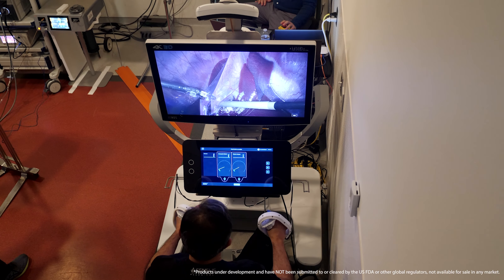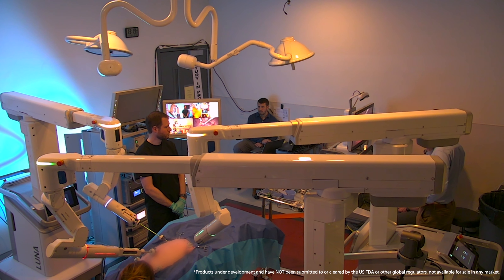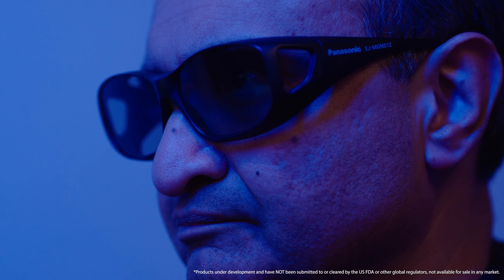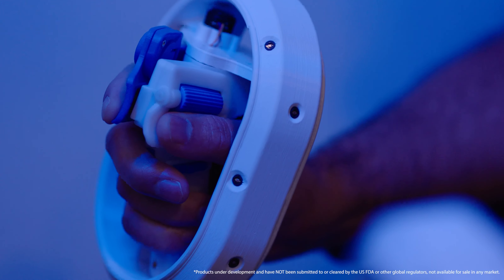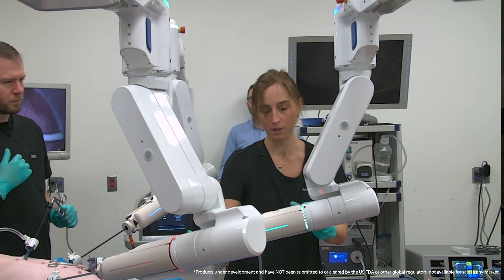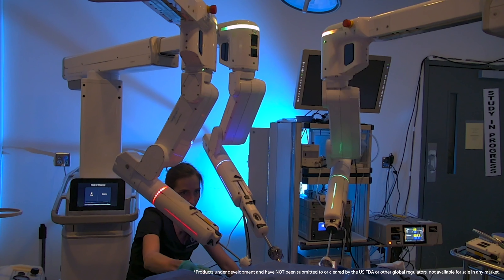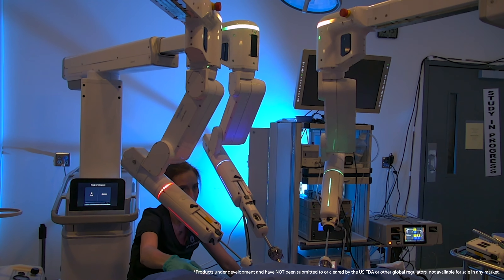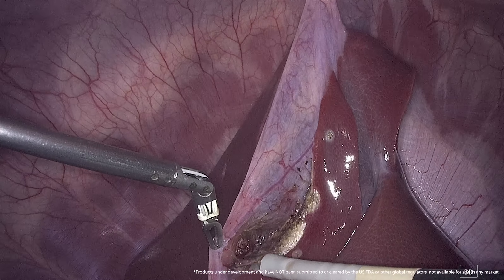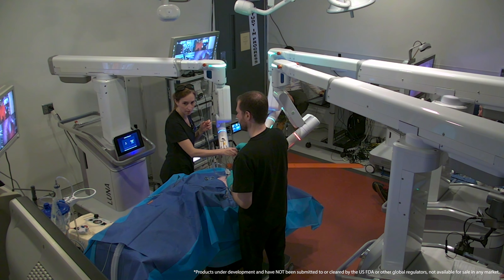I had the opportunity to use LUNA for the first time today. I had access to the entire room and they can hear me just using my normal voice without a microphone. I was able to see the patient without taking my head out of a console. The big difference with LUNA is that they're five millimeter articulating instruments, and that means a much, much smaller incision. We're going from eight to five and sometimes even 12 to five incision, and the patients are going to notice less pain, less discomfort, and certainly better cosmesis.